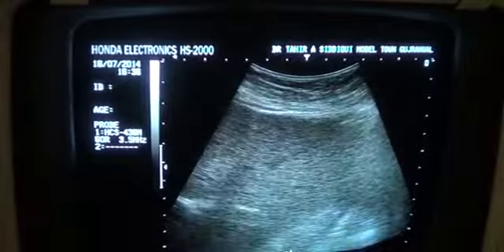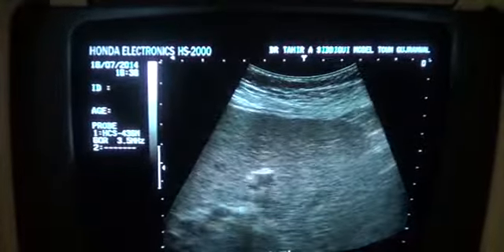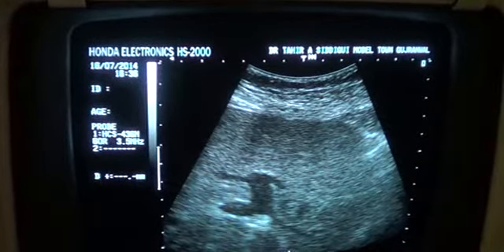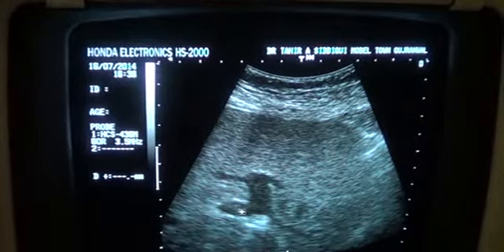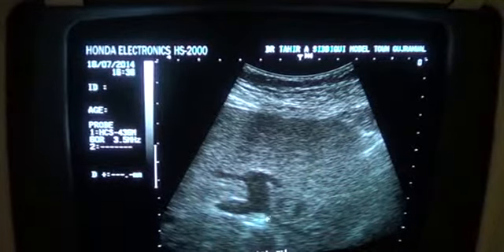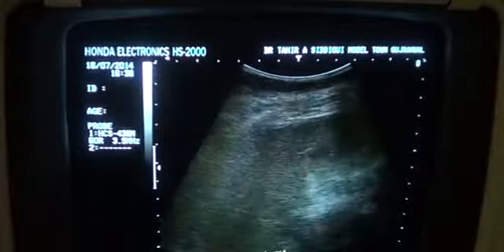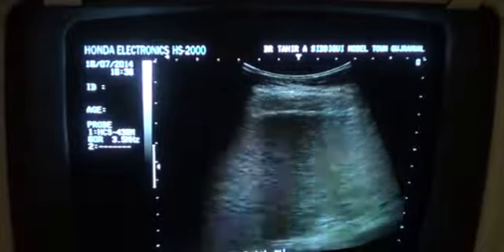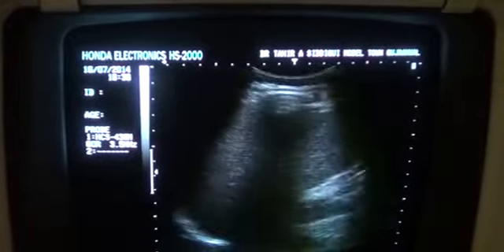So this is the left lobe of the liver. This is the transverse section of the left lobe. Here you can see the ascending part of the portal vein, left portal vein. This is the left portal vein and the branches entering into it. So this is a case of chronic liver parenchymal disease, with no focal lesion seen in it.